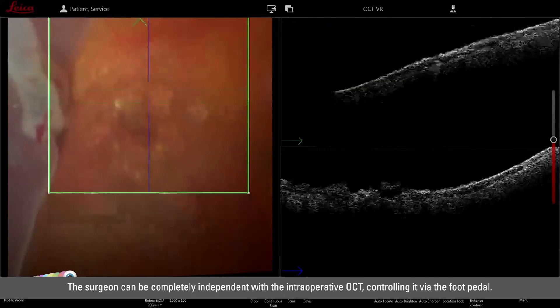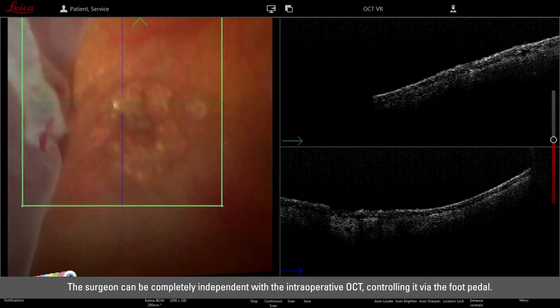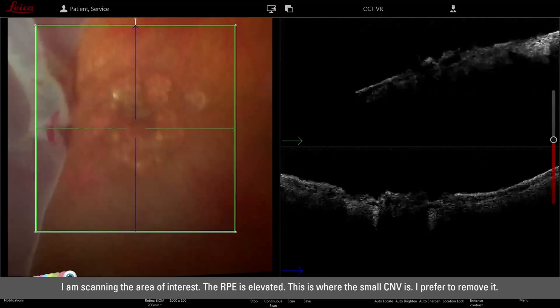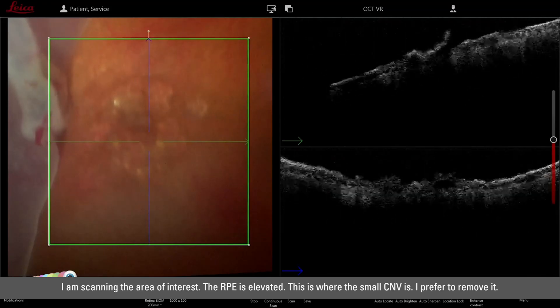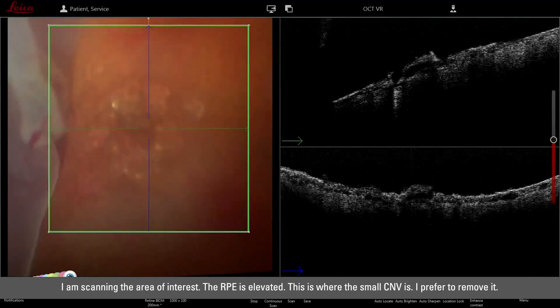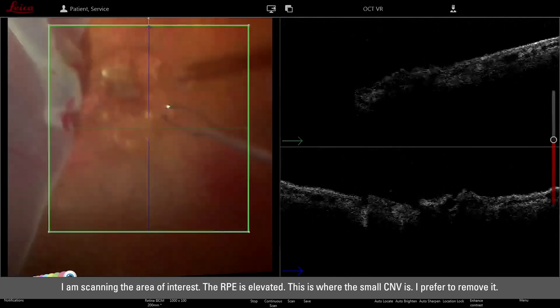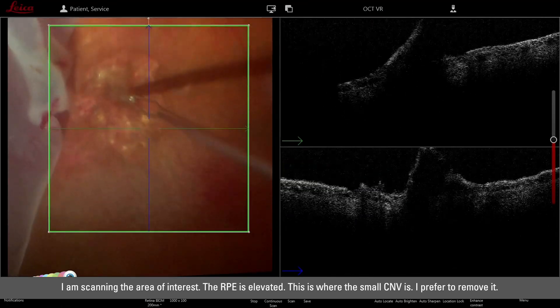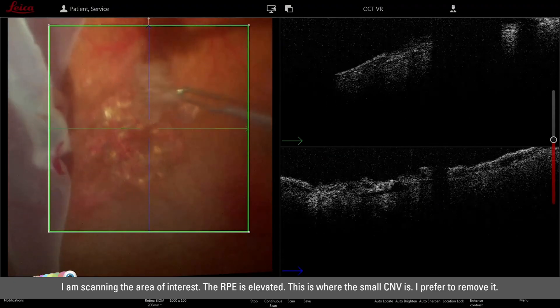The surgeon can be completely independent with the intraoperative OCT through the foot pedal. I am scanning the area right now — the RPE is elevated, I believe this is where the small CNV is. I prefer to remove it — yes, this is it.